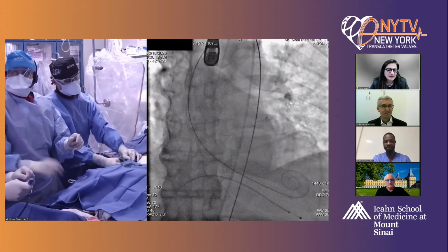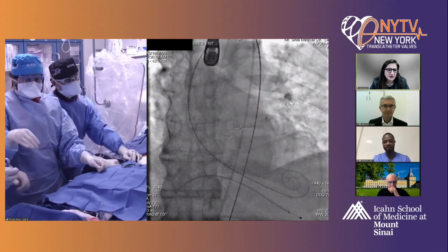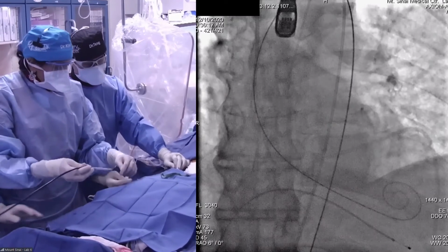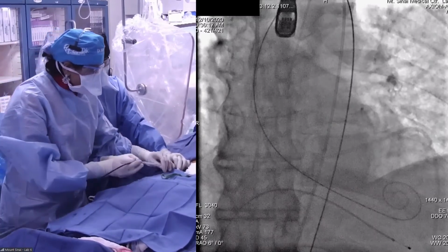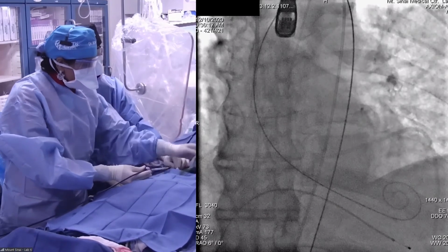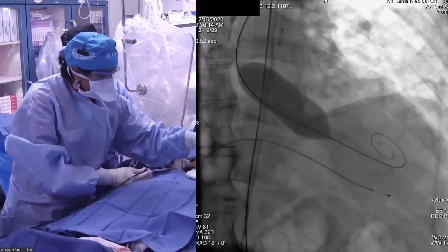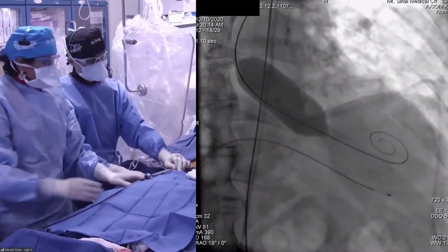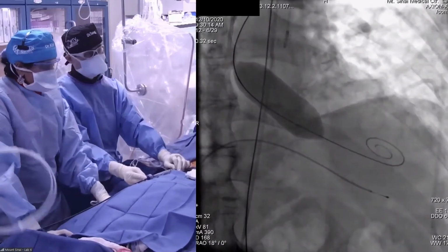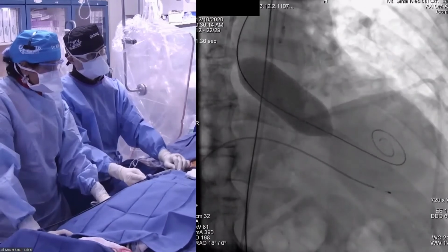And maybe you can tell us exactly what you're planning next, Dr. Kinney. Yeah, we've pre-dilated, and I think just to give the tips of what we already do. We have a dilated aortic root. We used AL1 with a straight Terumo wire. Now, bicuspid actually could be challenging to cross since it is a fused raphe, and the eccentric aortic opening could be challenging, but you were able to cross quickly here.